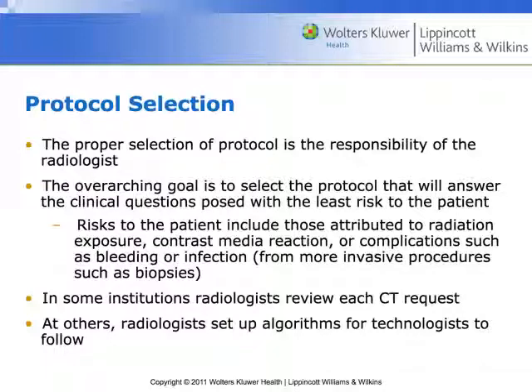In some places, like in New York, I don't even initiate the injection. They have a nurse load the contrast and initiate the contrast injection. I am solely responsible for the CT scan that results from that injection. Every other place I've worked, I initiate the injection, I pull the contrast, I do all those nurse-type things, and then I also do the scan.